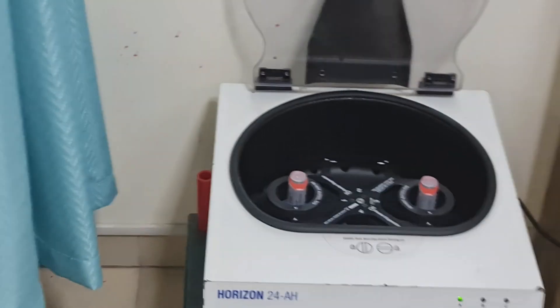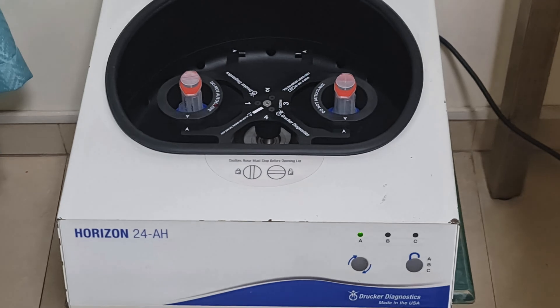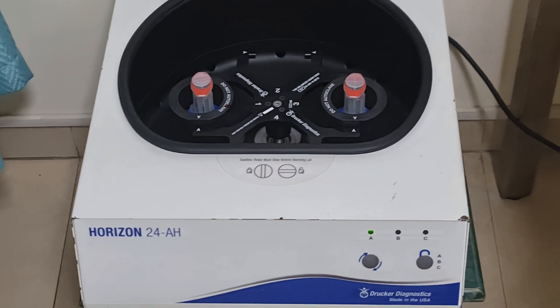Now we are ready — we have two syringes inside the centrifuge and we are ready to start. Okay, start.